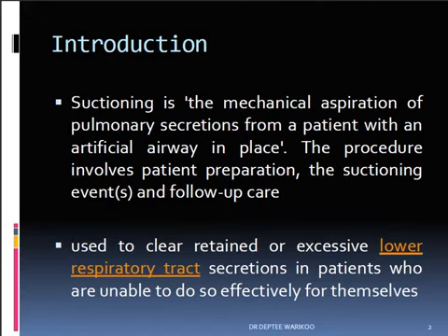This could be due to the presence of any artificial airway such as endotracheal or tracheostomy tube, or in patients who have a poor cough due to an array of reasons such as excessive sedations or any kind of neurological involvement. Having an artificial airway in situ impairs the cough reflex and may increase mucus production. Therefore, in the neonatal and pediatric ICU, suctioning of an artificial airway is likely to be the most common procedure. Mainly we do it in oropharyngeal or nasopharyngeal techniques.